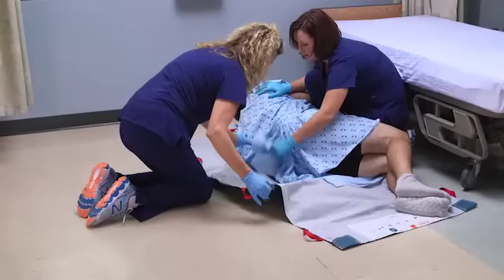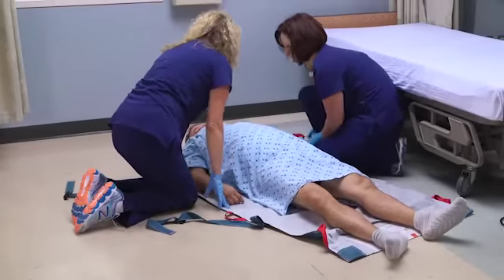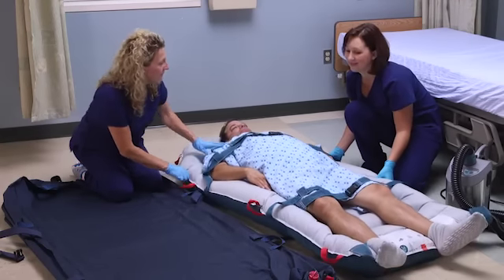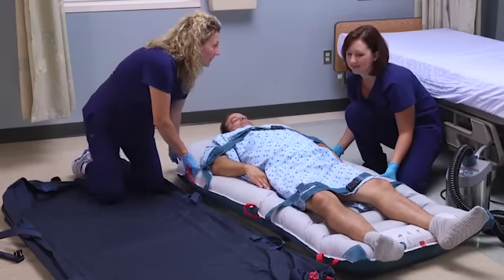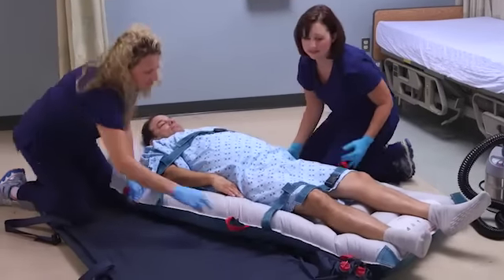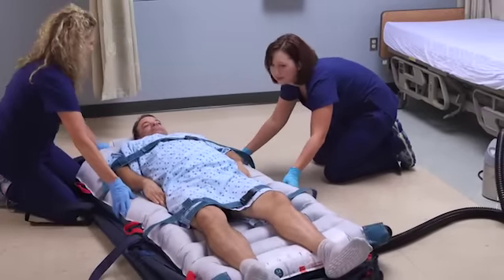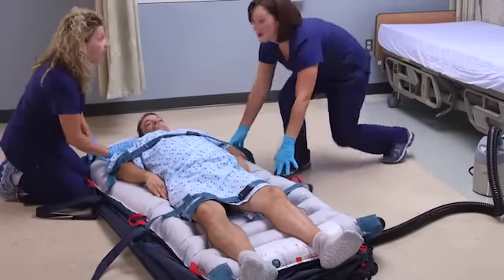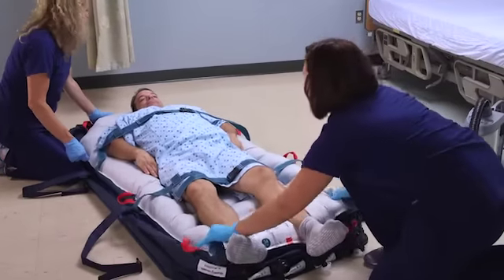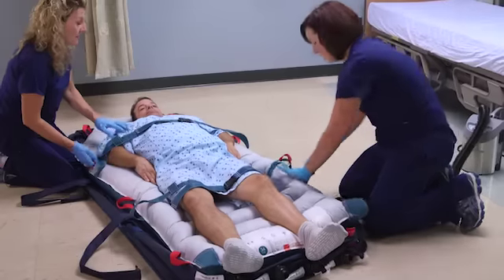Secure as much of the HoverMat under the patient as possible with a log rolling technique. Inflate the HoverMat and move the patient from the fall site onto the deflated HoverJack. Glide the inflated HoverMat at an angle over the long edge of the deflated HoverJack. Make sure that the patient's body is centered and that his or her head is below the head end seam of the HoverJack. Deflate the HoverMat and disconnect the air supply hose.